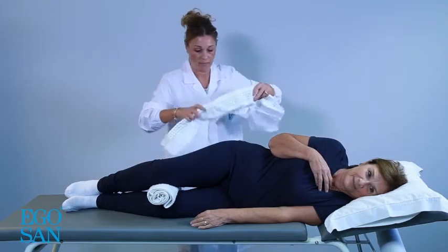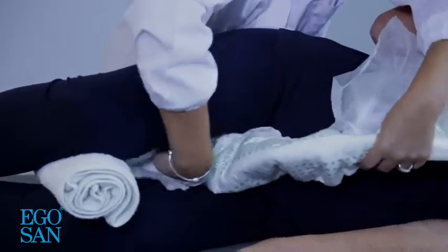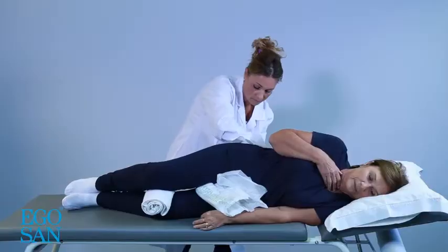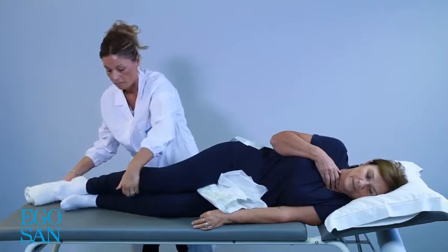If necessary, put a rolled up towel between the knees. Take the product and keep the breathable part closed. Keeping the pad folded, slide it between the legs from the front towards the back, ensuring that it fits snugly into the groin area.